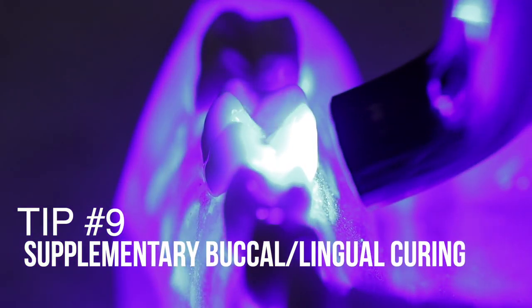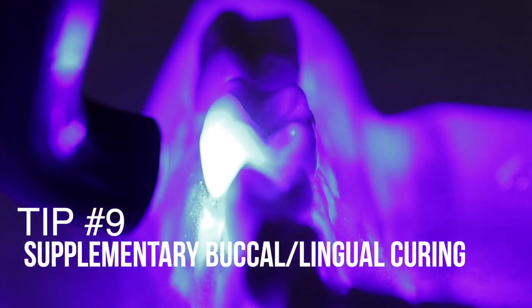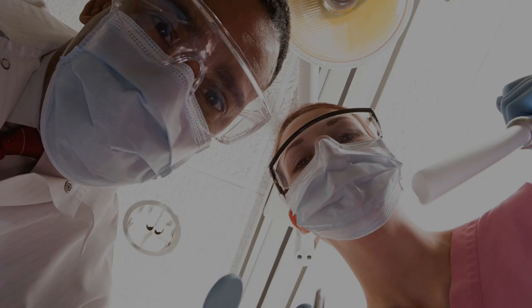Tip number nine: consider using supplementary buccal and lingual light cures. Normally we start by curing from the occlusal surface, but especially when material spills over to the buccal or lingual, or when doing MO or DO restorations, you really need to cure from the buccal and lingual surfaces as well. That gives you a different angle of cure and allows you to reach deeper areas of the preparation more effectively.